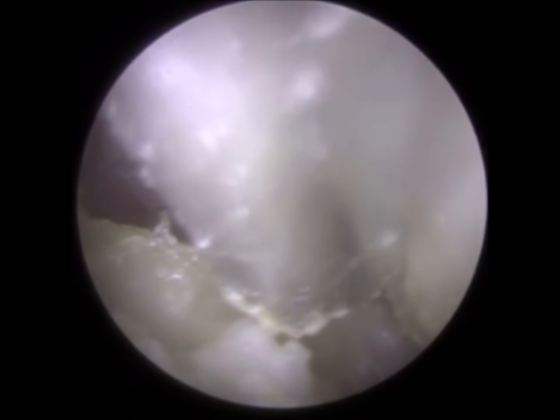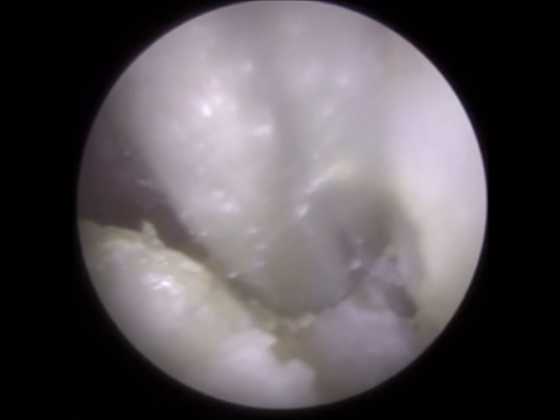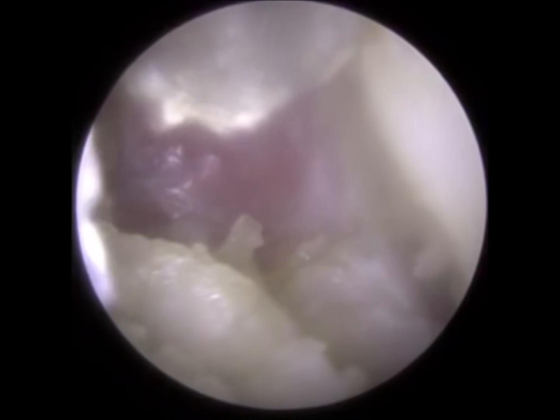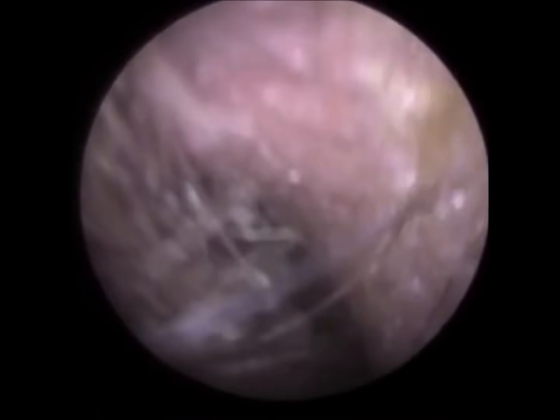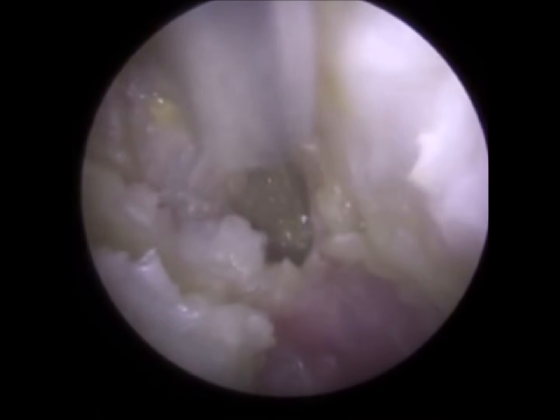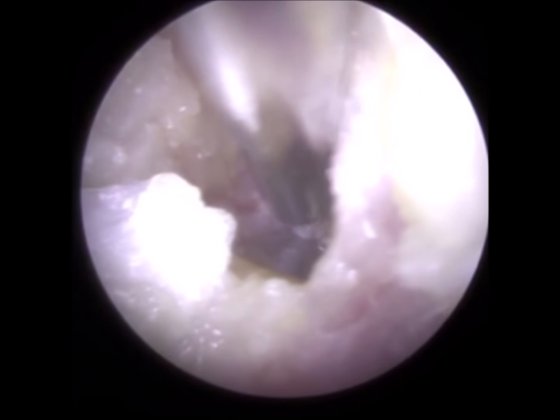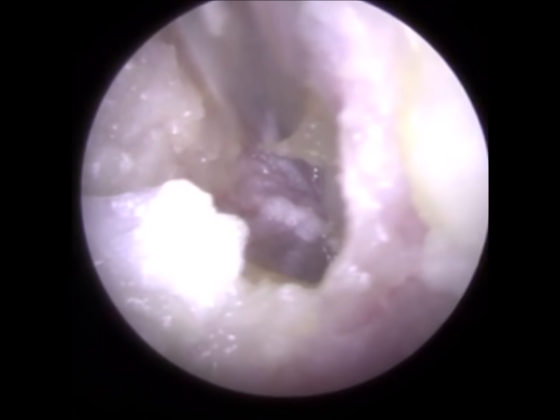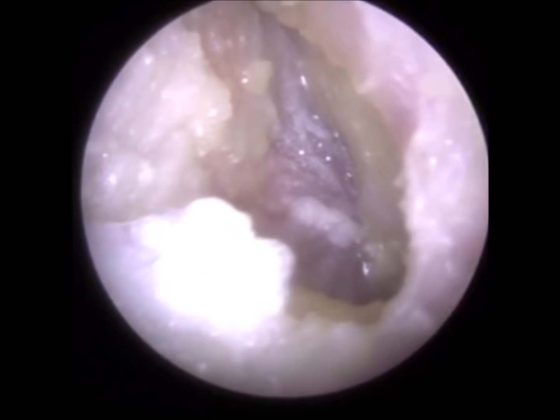So this is now where it's become apparent that the patient has got a few bony erosions. I'm right at the base of his ear canal. His eardrum is up and obviously in the distance, but the angle of this endoscope is almost going down towards the ground, and I've had to lift the endoscope horizontally to see the eardrum right in the distance, but you can see the bony erosion at the base, and the endoscope was literally tilted towards the floor to be able to view it. So it's becoming more and more apparent now that this patient's got some underlying problems, more serious problems, should I say, than just this infection.